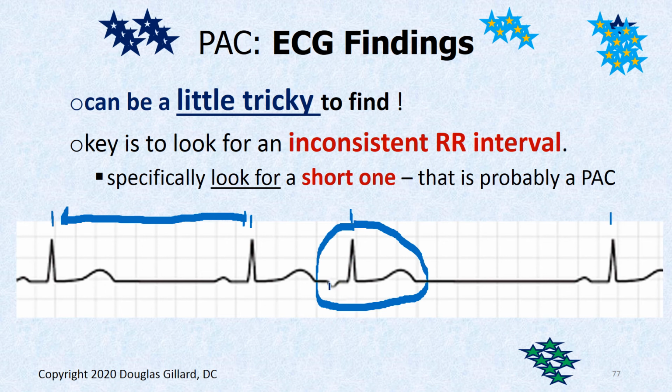It's inverted, right? There's a P wave, P wave, P wave. This one's upside down. And because there's a nice long PR segment here, this is not coming from the junctional region. And then we go by the rule, right is upright, and left is the opposite. So this is a PAC coming somewhere from the left atrium. And yeah, that's a run-of-the-mill PAC.